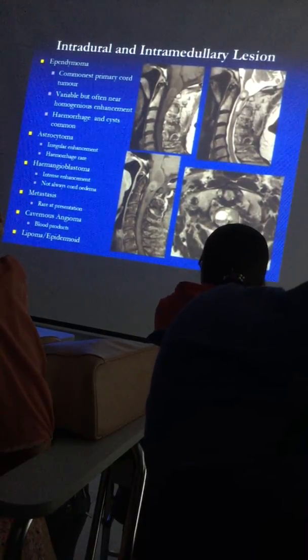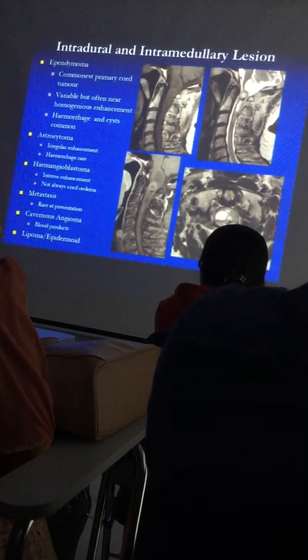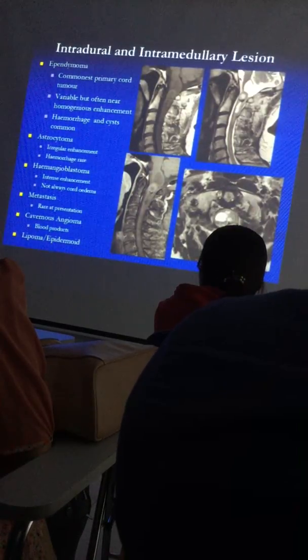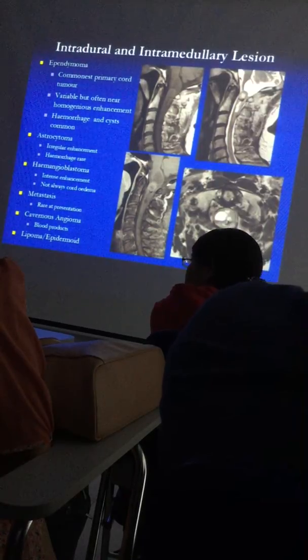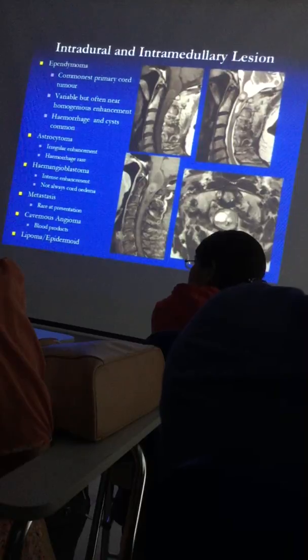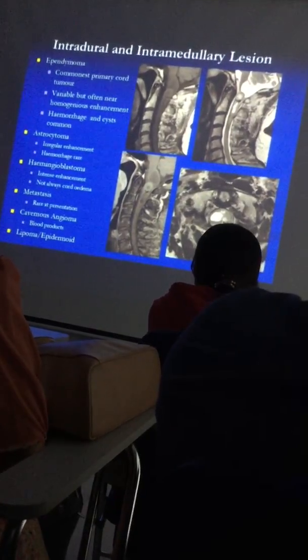Metastasis, again, is a rare presentation, but not uncommon as a late presentation of disseminated malignancy. The cavernous angiomas, where often all we see is blood breakdown products, so there'll be hemosiderin staining, maybe bright on the T1s, and often not an enhancing lesion attached to that.